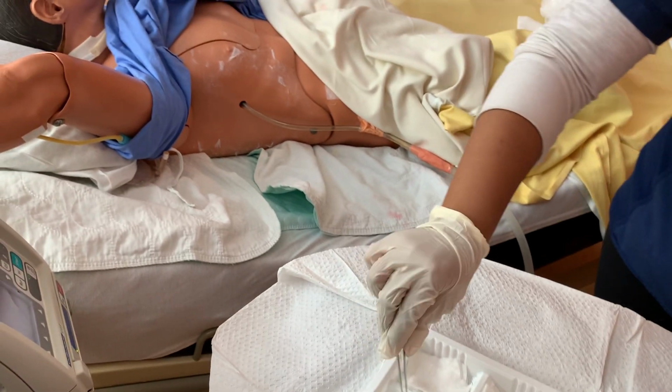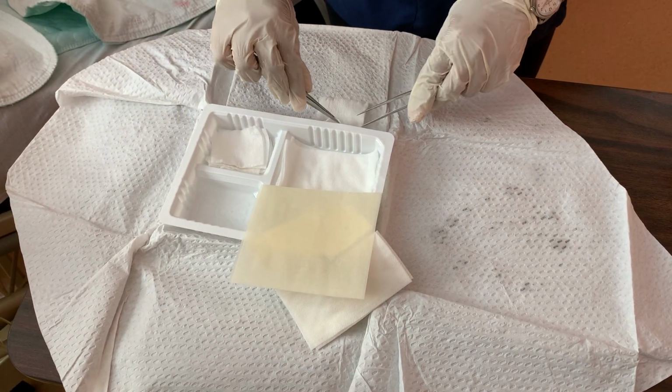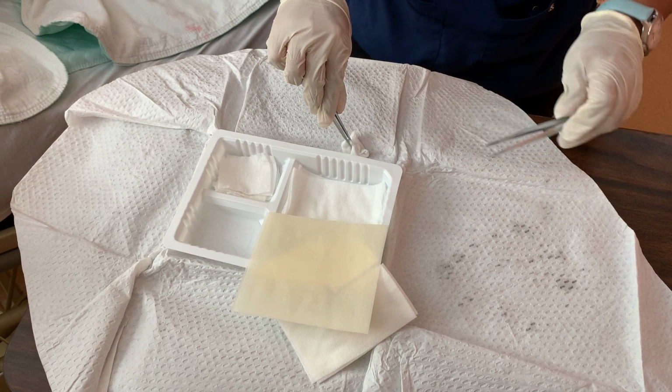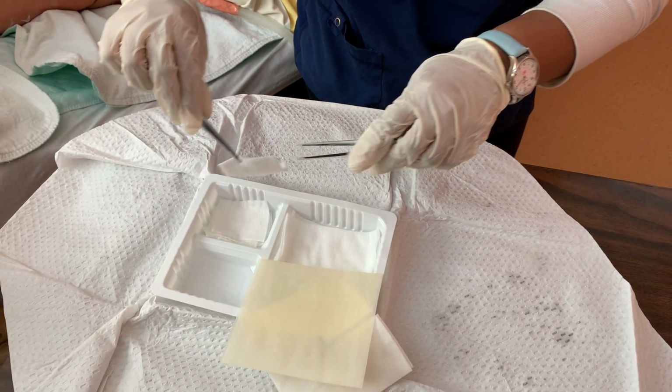Dip it again, and we're gonna go a little farther out. Throw it away. Dip it in, go even further out. Okay, so I think that's fairly clean. My forceps are still sterile. It did not touch my patient.